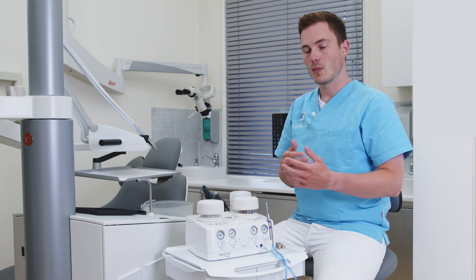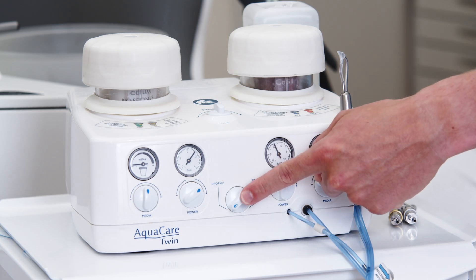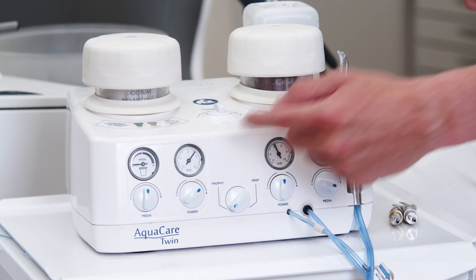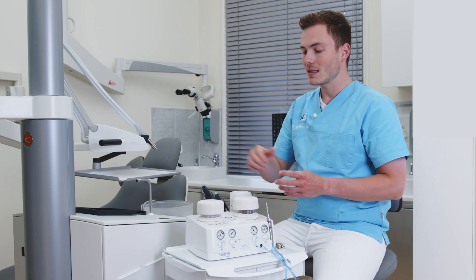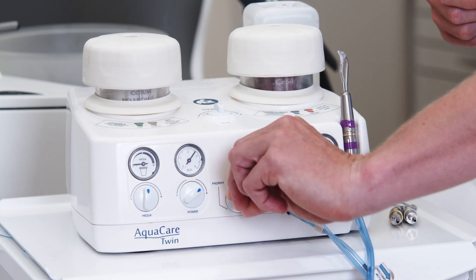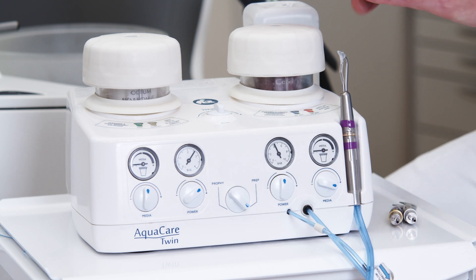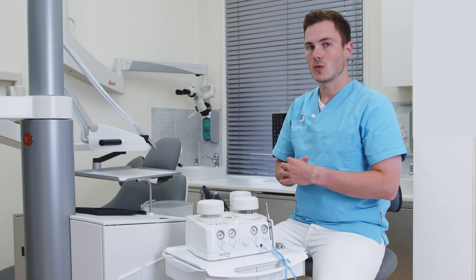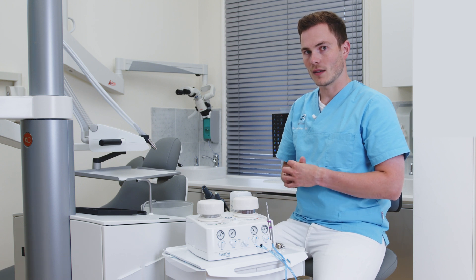If I would like to switch between both compartments, I can use the switch that is here in the middle. Right now the blue dot is pointed towards the left compartment, which means the left compartment is activated. If I turn this switch to the right side, I have now activated the right side — that's how I can easily change between different powders during treatment.